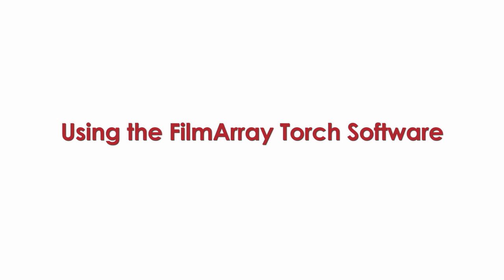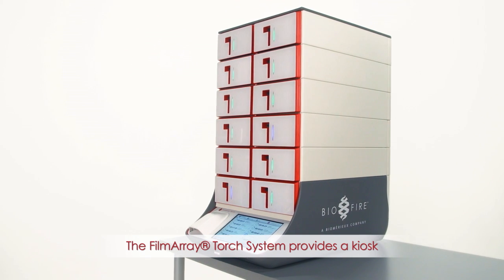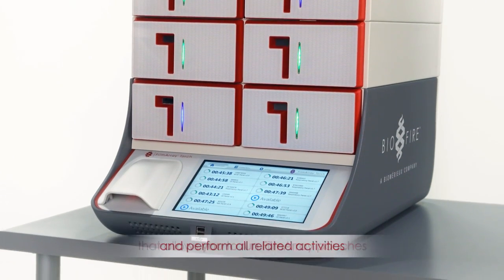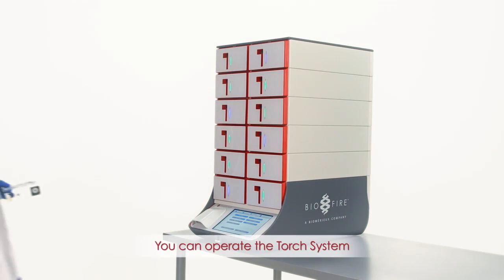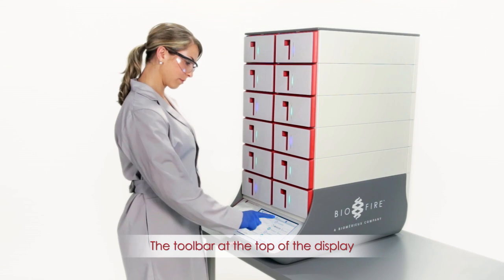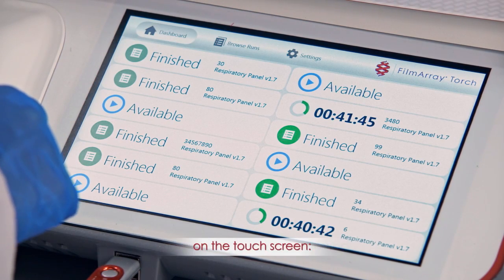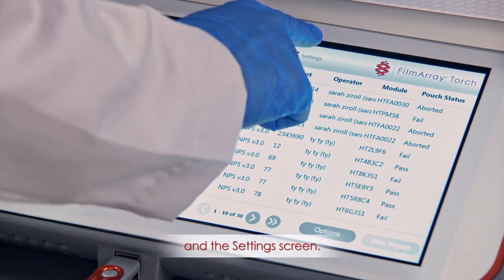Using the FilmArray Torch software. The FilmArray Torch system provides a kiosk known as the system base that allows you to run FilmArray pouches and perform all related activities in a high-throughput environment. You can operate the Torch system by using the touchscreen on the system base. Toolbar. The toolbar at the top of the display provides options that enable you to move between the main interfaces on the touchscreen: the dashboard screen, the Browse Runs screen, and the Settings screen.